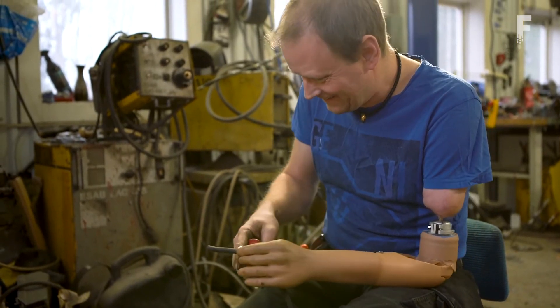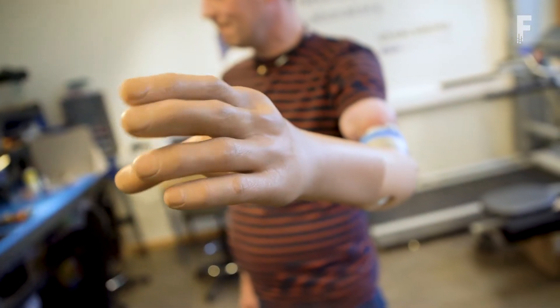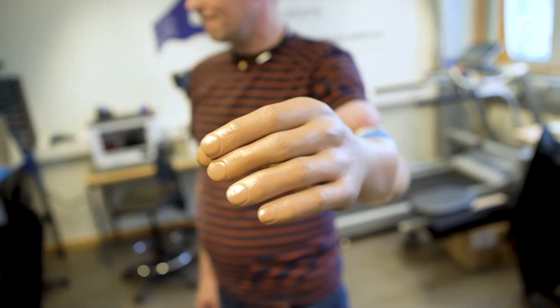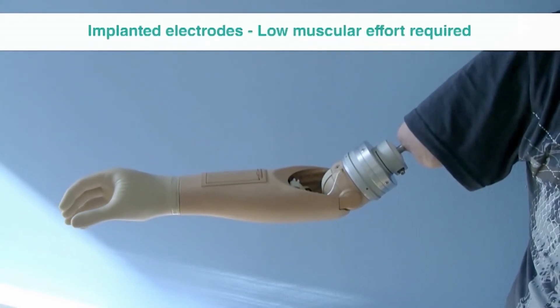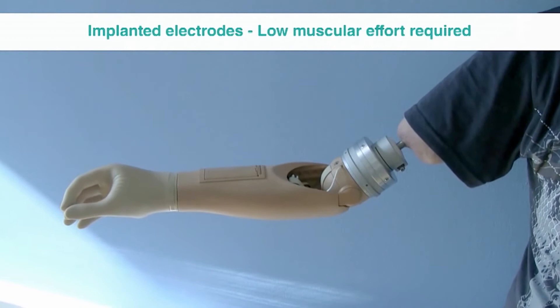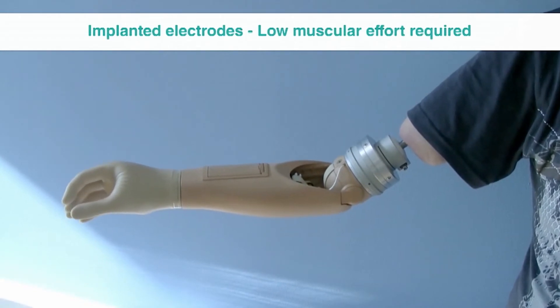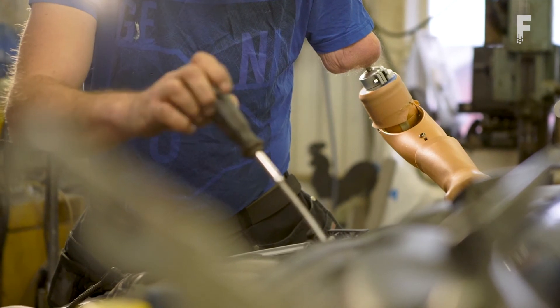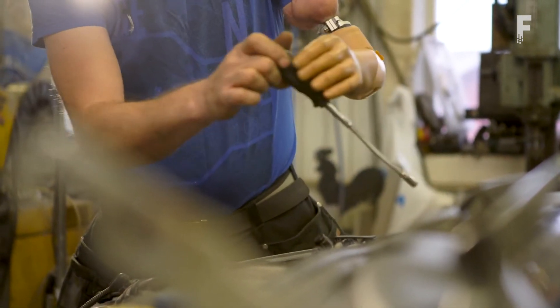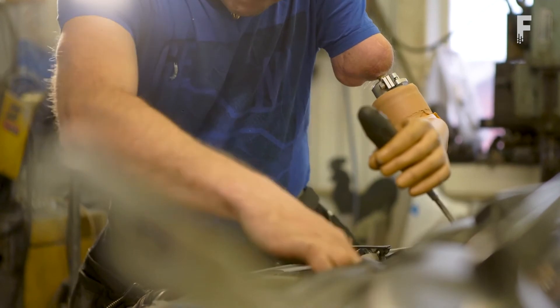If a person wants to move a finger, the prosthetic finger moves. The beauty of this type of technology is that it's bi-directional. After the finger moves or touches something, the signal is then fed back to the sensors wrapped around the nerves. The nerves receive the signal and send signals to the brain that create a feeling of realistic and immediate sense of touch.